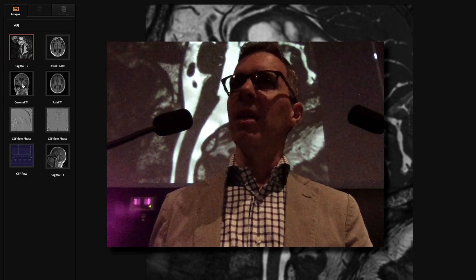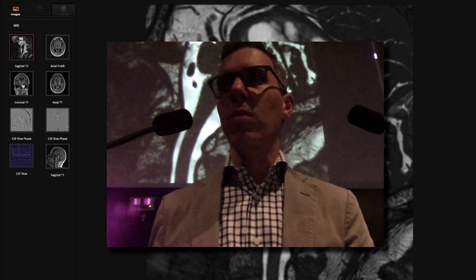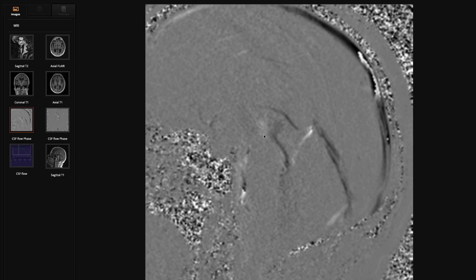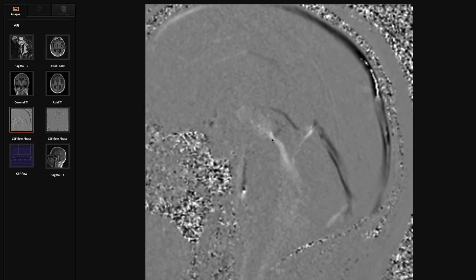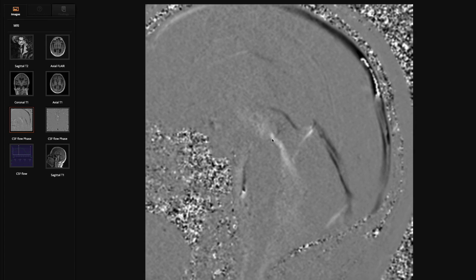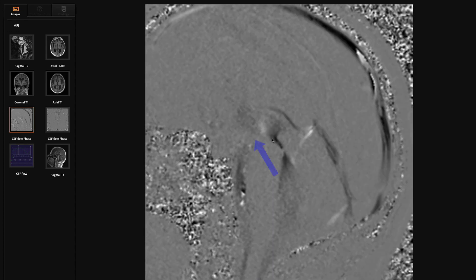In this age group, how many elderly patients have a bit of a wobbly gait — they might have had a hip replacement? So here, what you're seeing in black and white is that during each cardiac pulsation, during systole, blood pumps into the brain, the brain parenchyma increases in volume, it therefore displaces CSF out of the lateral ventricles inferiorly through the aqueduct. Then during diastole, as that blood drains out of your head, your brain empties of volume and it sucks that fluid back up.